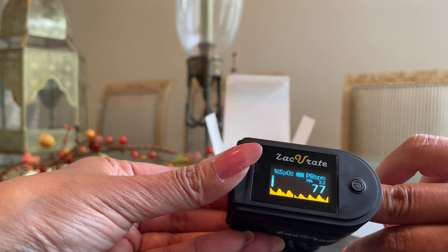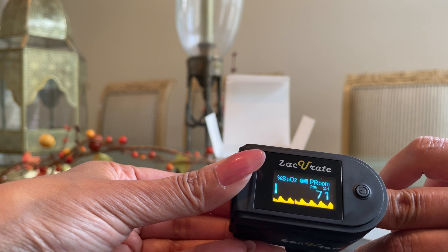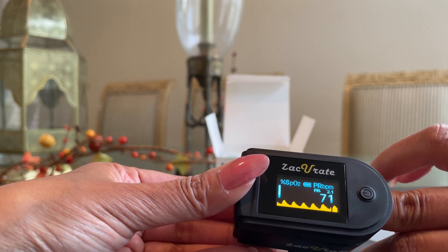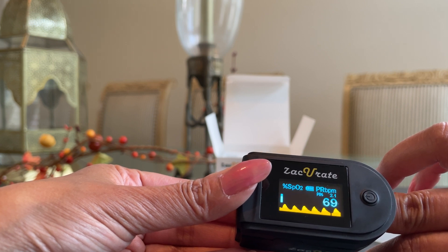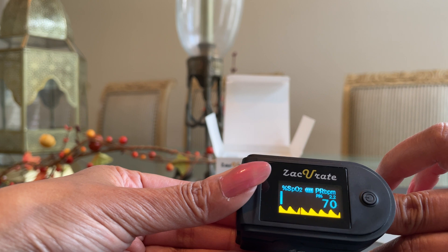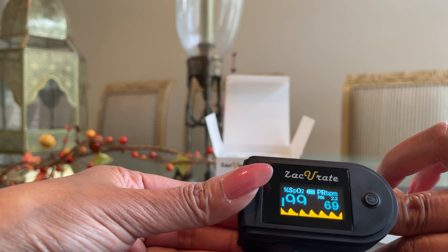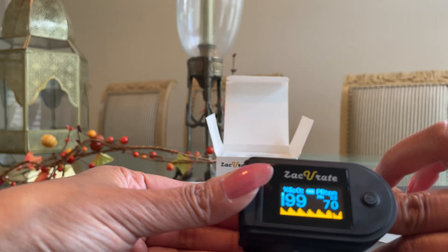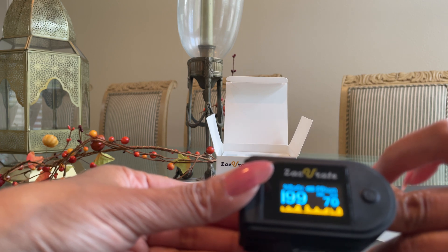There are my results — it read very quickly, almost instantly. Eight to ten seconds is what it usually takes to read a result. The first number you're seeing, blinking under 'SpO2 %', is my blood oxygen level — 99. The next label is PR BPM, that's my pulse rate or heart rate per minute. Those are both normal results. This gadget only reads your oxygen level and pulse rate — it does not read your blood pressure.